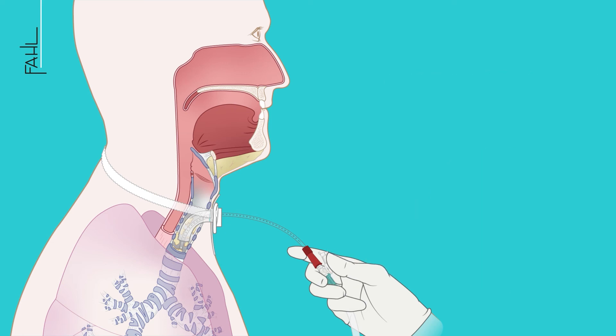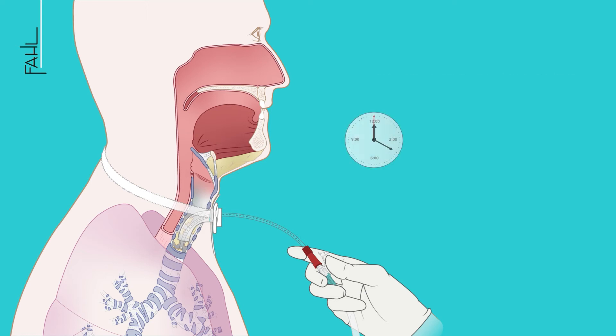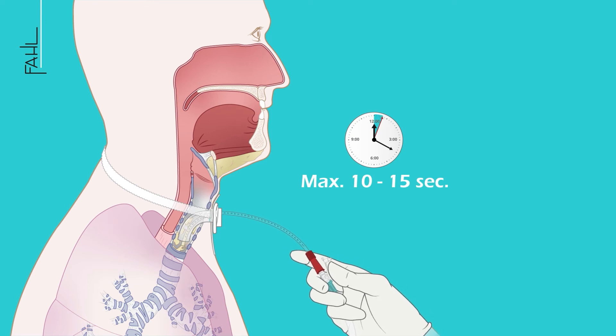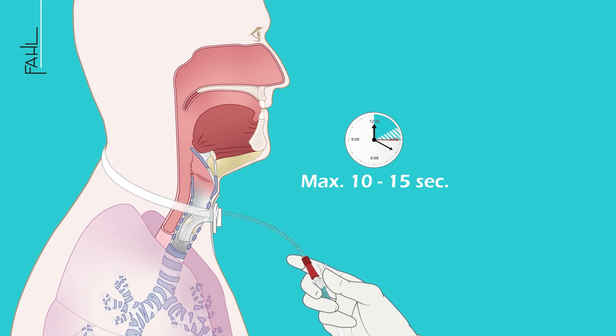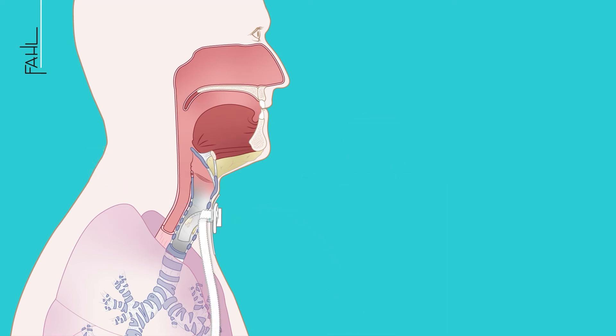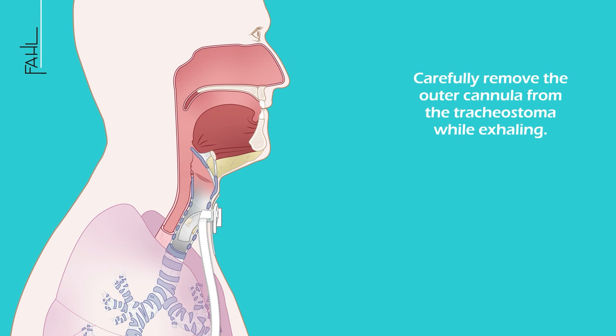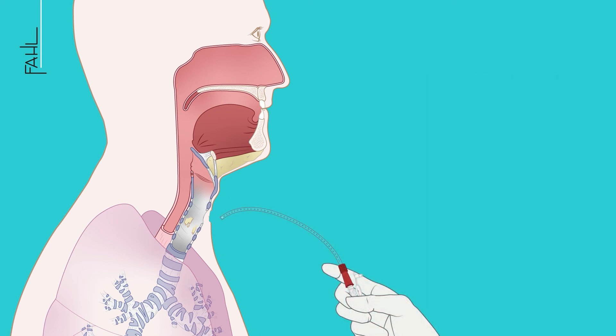Make sure that the individual suction process does not last longer than 10 to 15 seconds. Loosen the cannula support band on one side and ensure that the tracheostomy tube remains in the correct position. Carefully remove the outer cannula from the tracheostoma while exhaling. If necessary, repeat endotracheal suctioning.